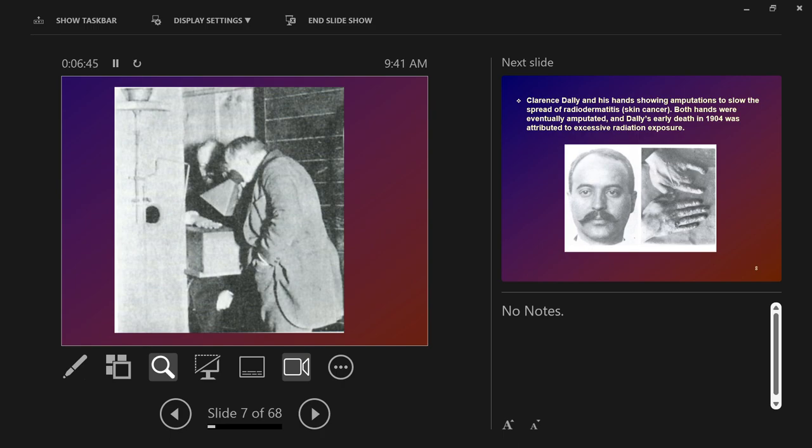The x-ray machine, the tube, the thing that produced x-rays, for you guys who are new to us, it's kind of like a light bulb, okay? The thing that produces the x-rays, as you know, a light bulb sends light in all directions, right? The same is true of an x-ray tube if it's not collimated, if it's not controlled. This is not controlled. This is just a box around a thing that produces x-rays, okay? And the x-rays go in all directions. So they travel in all directions.